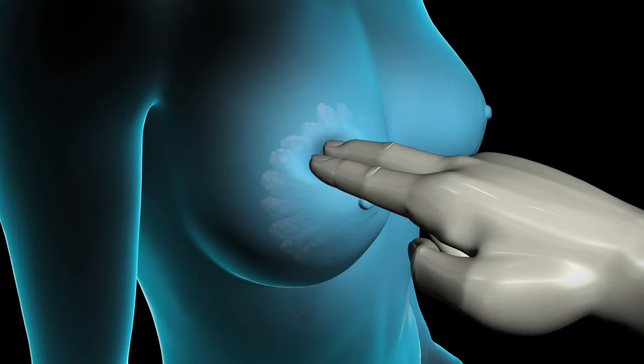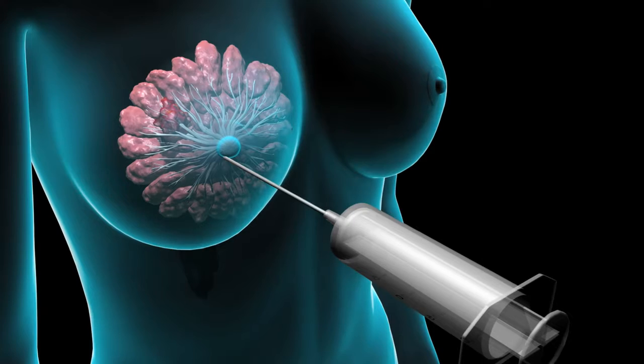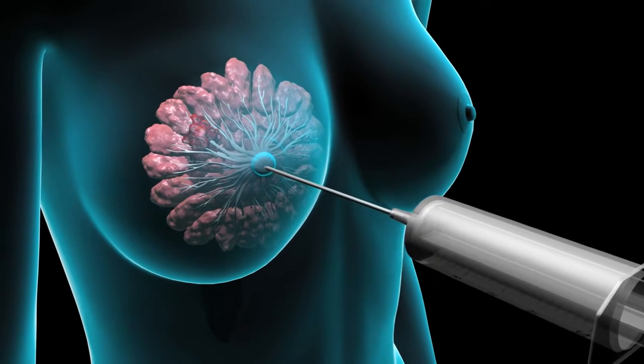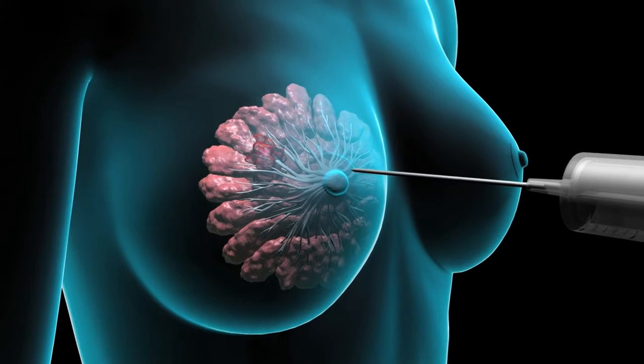If your physician can feel your lump, he or she will often perform a needle biopsy, which may take the form of a cyst aspiration, fine needle aspiration biopsy, or core biopsy.